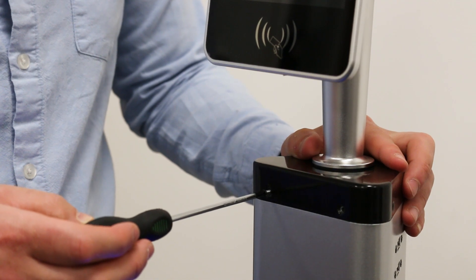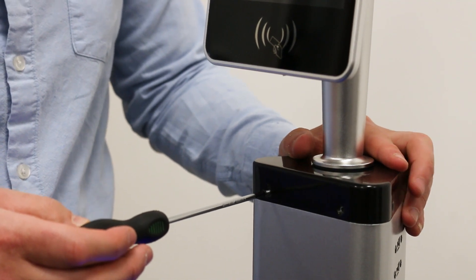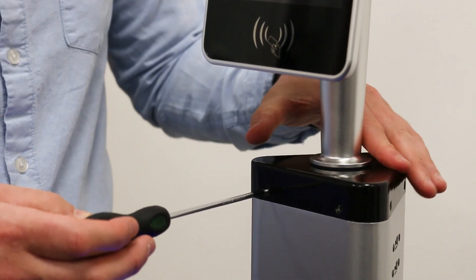The next step is to use the four screws provided and connect the device to the pedestal unit.